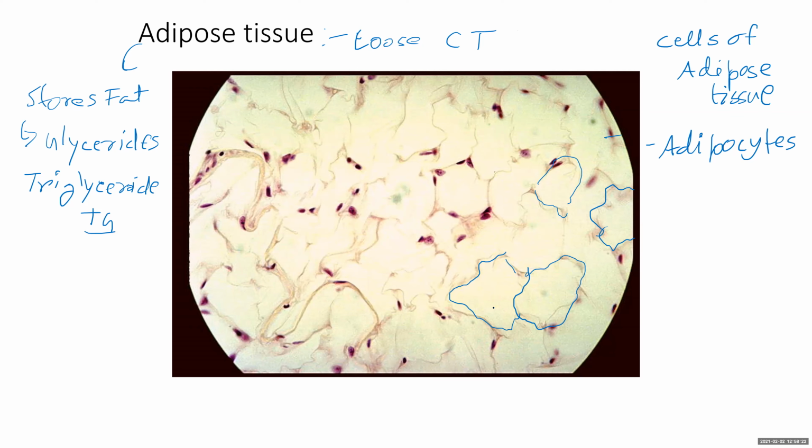It almost looks like the cells are making contact with one another like an epithelial tissue, but really not. So this sample, the cells are just filled with so much triglyceride, they have ballooned. Imagine a collapsed balloon, a slightly filled balloon, and a bunch of highly inflated balloons. Basically, that's what these adipocytes are. You can also see that although there is so much fat, the fat has basically moved the nucleus to one corner of the cell.